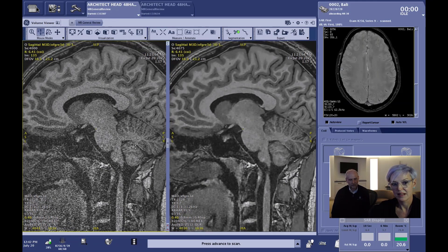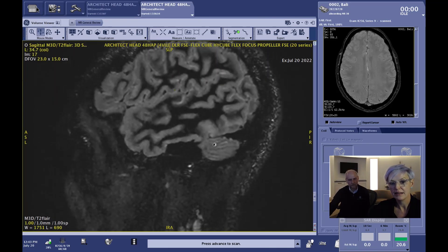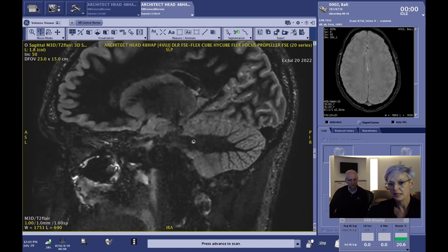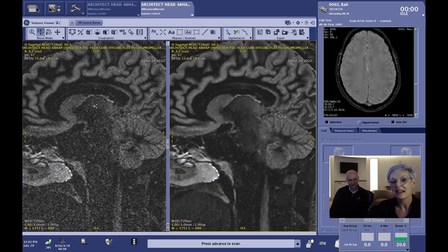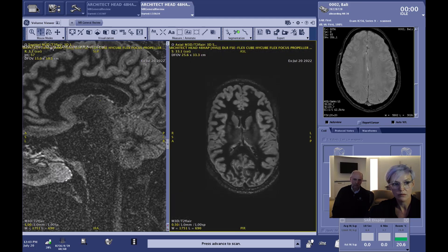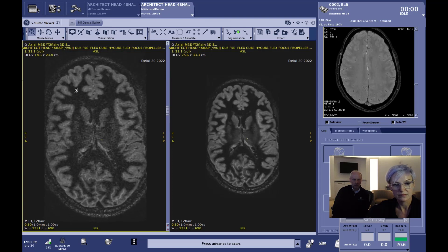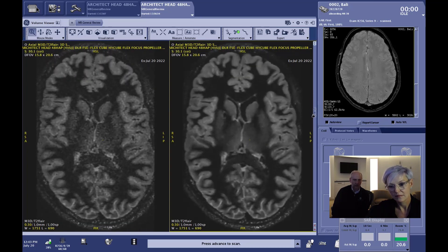The second sequence scanned was the Cube DIR. With Air Recon DL, the image quality is excellent — as a reminder, the pixel size was isotropic at 1mm in each direction. Comparing to the same data set reconstructed without Air Recon DL on the left, the difference is clear: when suppressing three different tissues you cannot accelerate as aggressively or use such a small voxel size. Previously you would go to 1.4 or 1.3mm to maintain reasonable scan times, but here we can achieve 1mm isotropic. Looking at the reformats, the sharpness and quality of the reconstructions are dramatically improved with Air Recon DL.